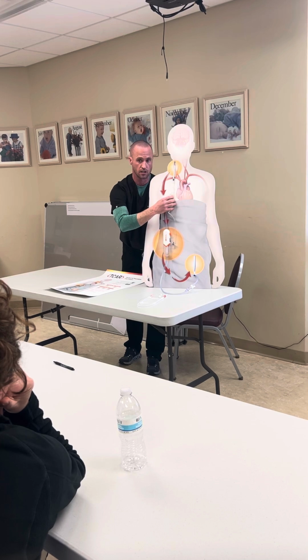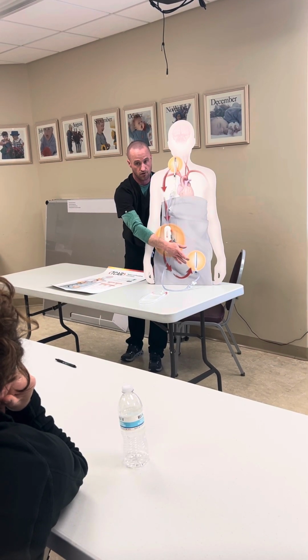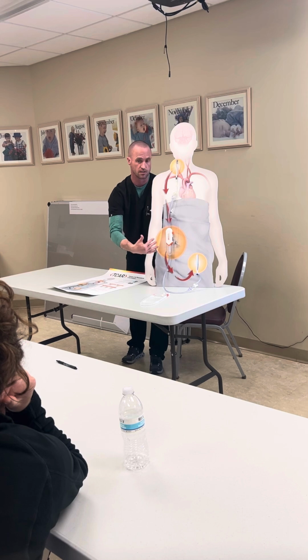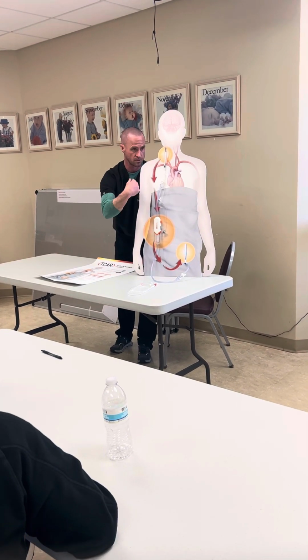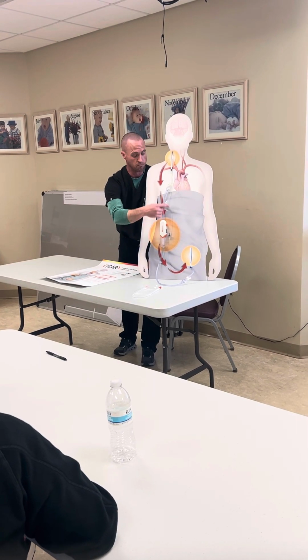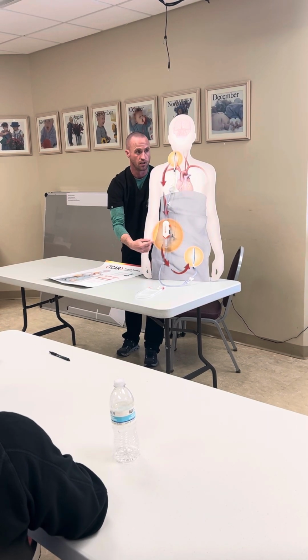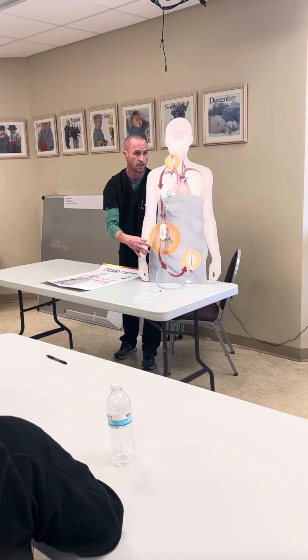If I were to hook this arterial sheath up to an arterial sheath in the femoral artery, so like say we got femoral arterial access, which can happen, we won't get any flow through it, and it'll just stop. You'll notice it. But if you're hooked to venous, it'll flow nicely. And it hums. It's essentially the same pressure as the patient's pressures. But we're doing this so that while we're ballooning and stenting the carotid, we're protected the entire time. Nothing crosses the lesion before we're protected, before we're on flow reversal, so to speak.